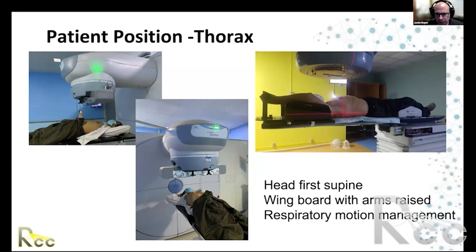In that case, there can be an upfront conversation with the physician and nurse about pain management, and then we can do some things on the back end to provide a bit more support, either with a towel or a cushion to make it a bit more comfortable. What you'll notice in this case is that the patient's hands are holding on to lock bars, and these lock bars are indexable, and that is used to more consistently reproduce arm positioning.